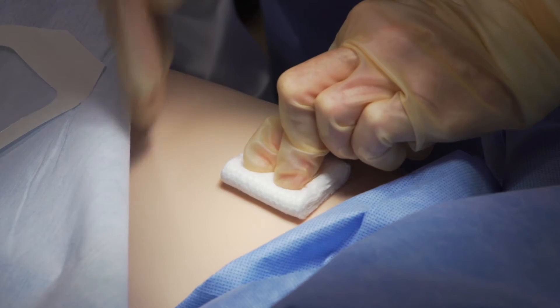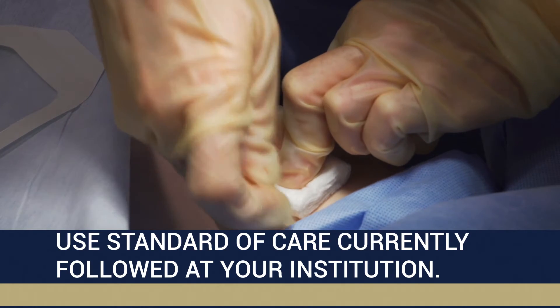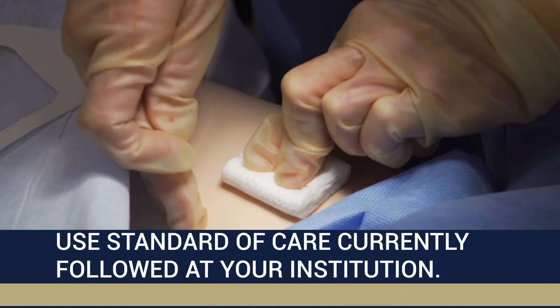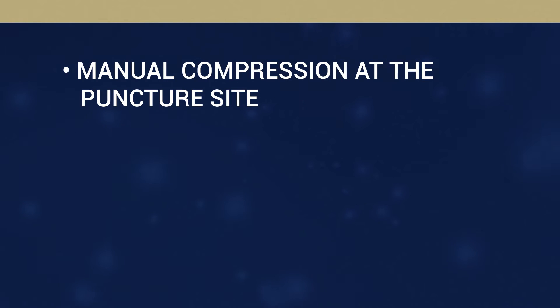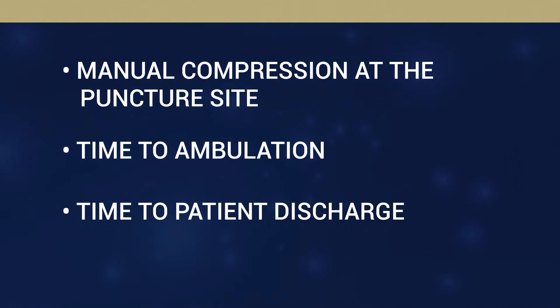Following placement of the hemostatic pad, healthcare professionals are encouraged to continue to use the standard of care they currently follow at their institution regarding manual compression at the puncture site, time to ambulation, and time to patient discharge.